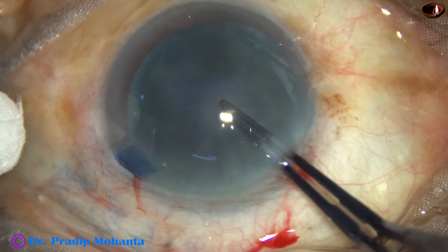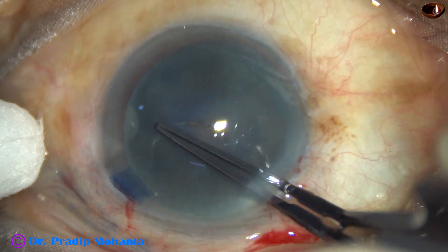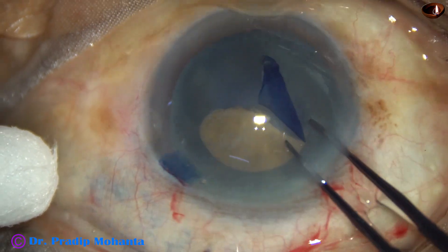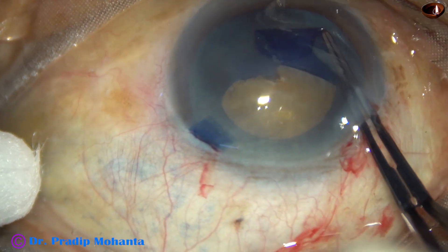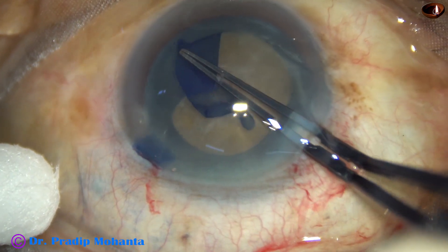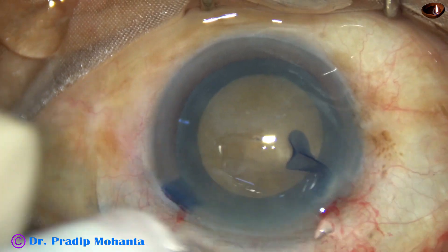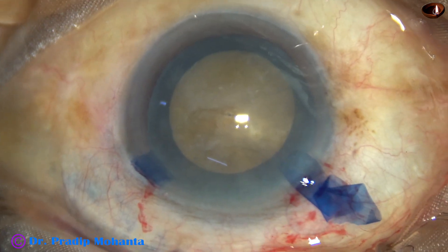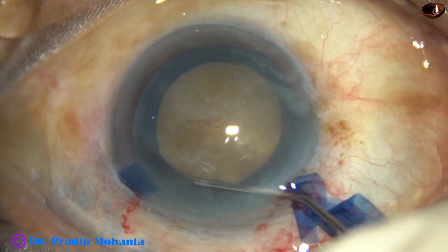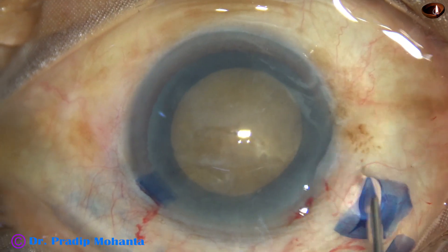The tip of the capsular forceps pierces the center of the anterior capsule and moves radially. The capsular tag is held by the tip and guided anti-clockwise, remaining at a certain distance from the border of the iris. A large, adequately sized rhexis of about 5.75 to 6 millimeters is achieved.